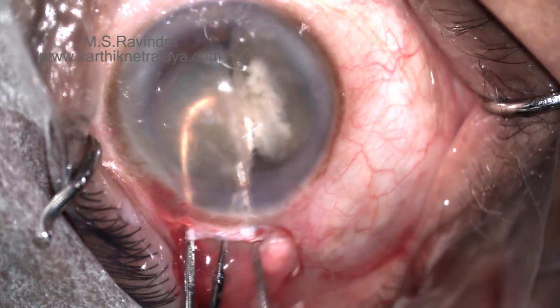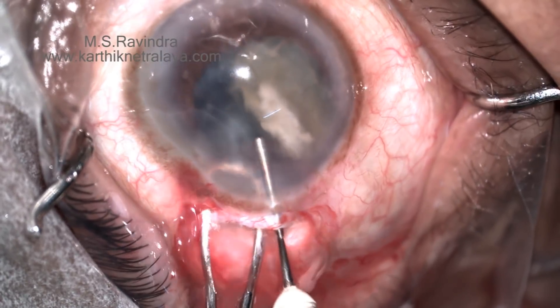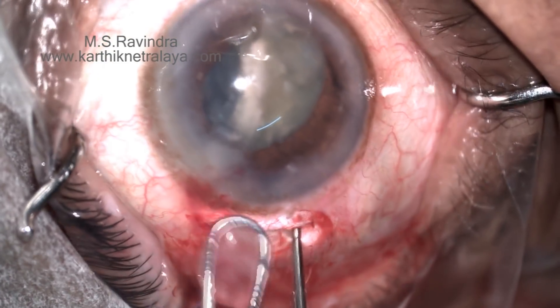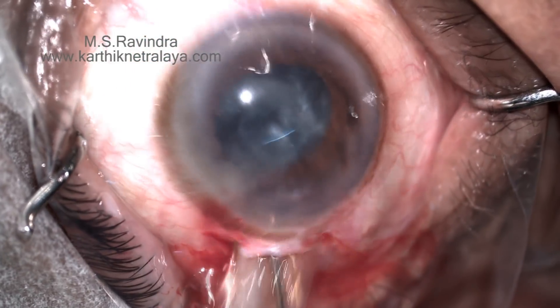Endothelial protection is of paramount importance in this step. The hemi-nucleus is removed. You can see that there is no stretch on the tunnel, which eventually results in a very small surgically-induced astigmatism of less than 0.4 diopters.